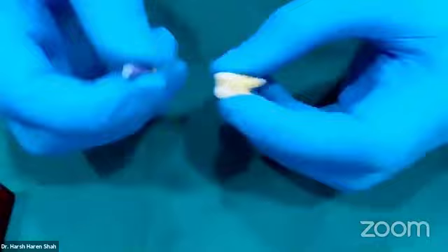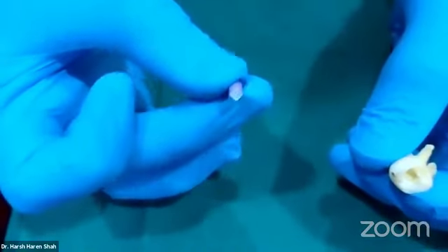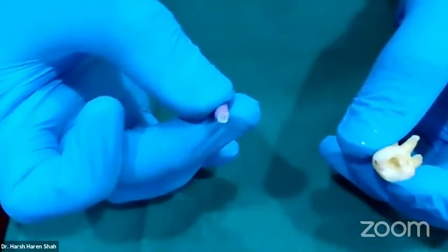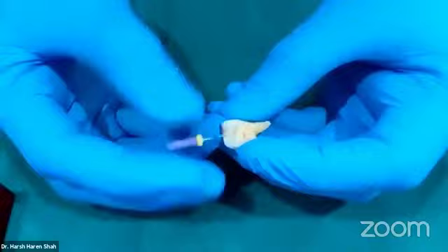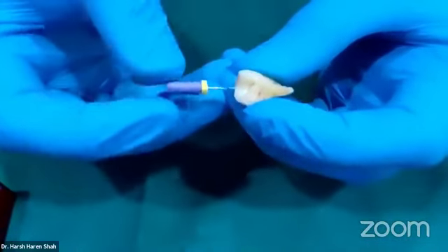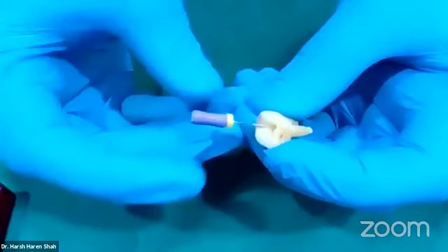Now, because we are doing a demonstration, let me show you how you use the watch winding motion as well. What you do is you hold it between the thumb and one finger, and you keep going clockwise, counterclockwise, clockwise, counterclockwise. This is precisely what watch winding means. So let us put it into this distobuccal canal. Now I'm putting it very passively right now, okay? And it seems to be going to a length of about 13 millimeters. But I know that this canal is a little longer than that.